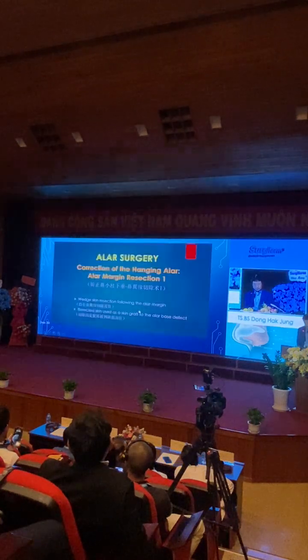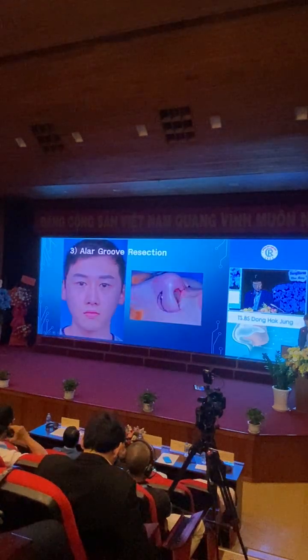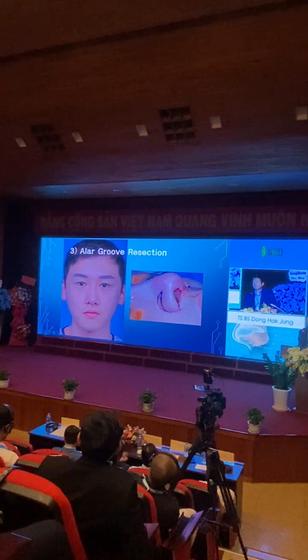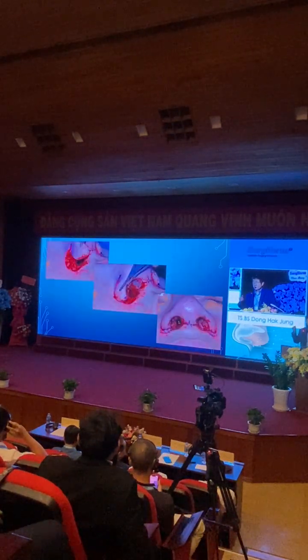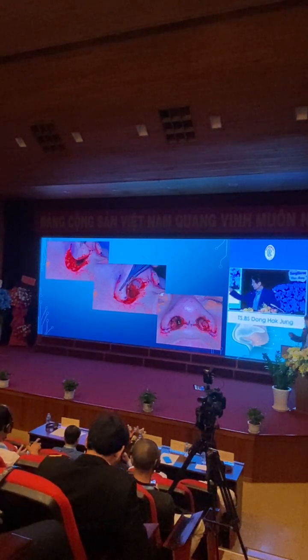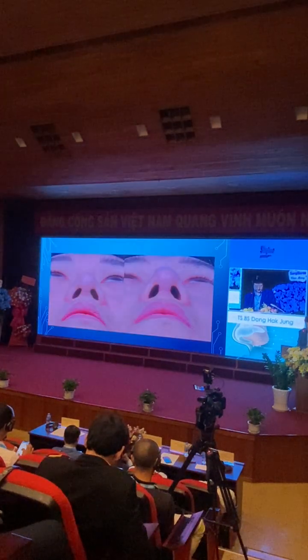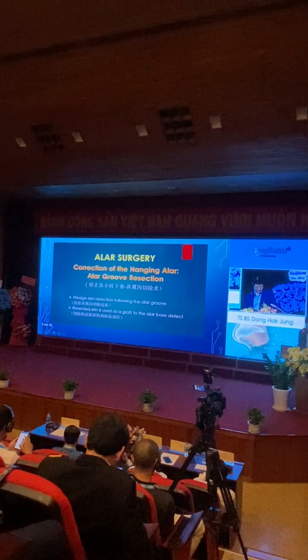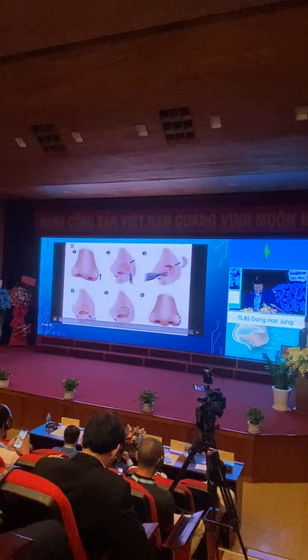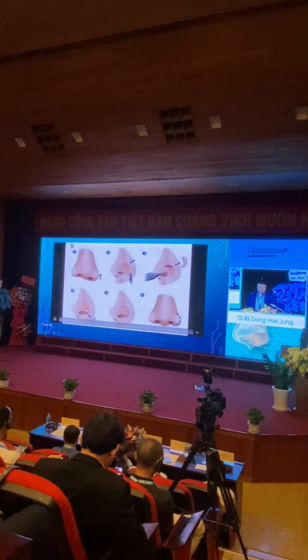The other way, you can cut here and then go up. It's very effective. If you want a strong effect, like this cut, it's possible. It's like this, cut, go up, and then the skin from here to here.